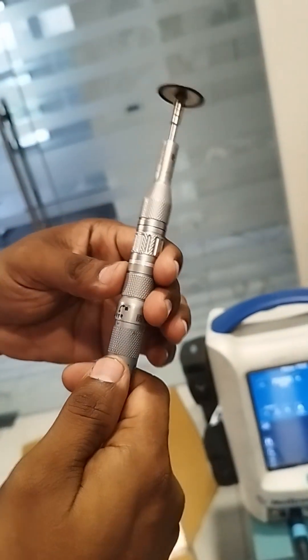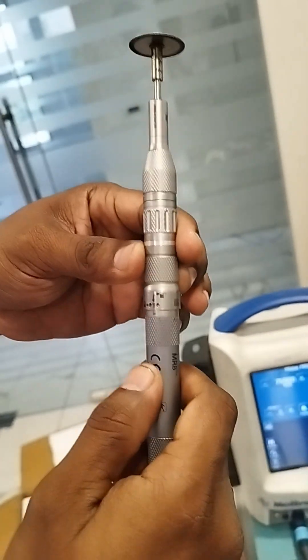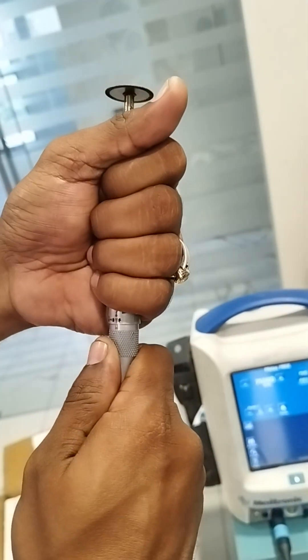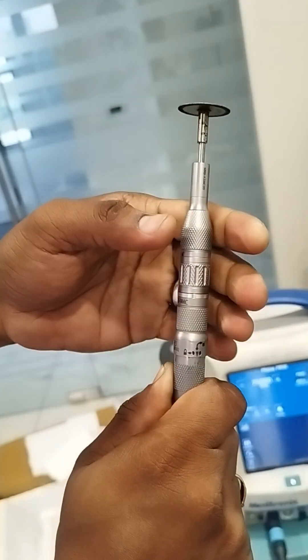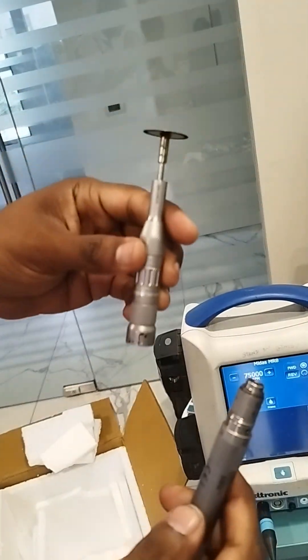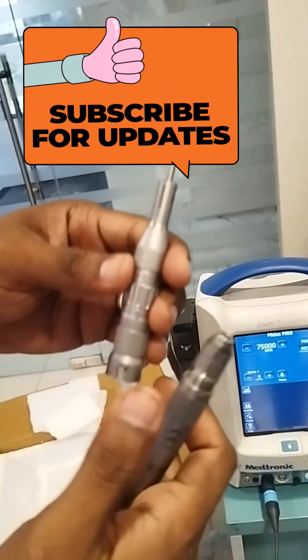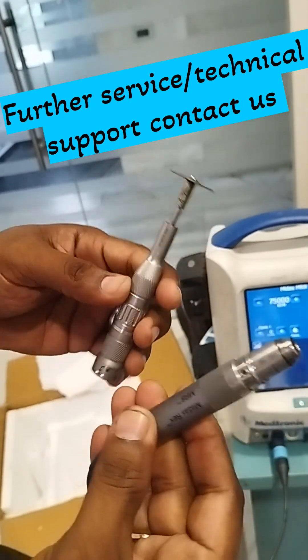If you want to remove it, the mechanism is different. You need to pull the attachment up and then rotate — only then will it come out. This is the assembling and dismantling technique of the metal cutter attachment on the MR8 motor. Thank you.